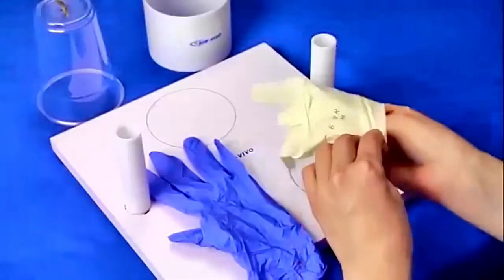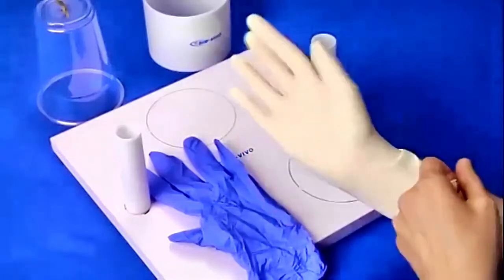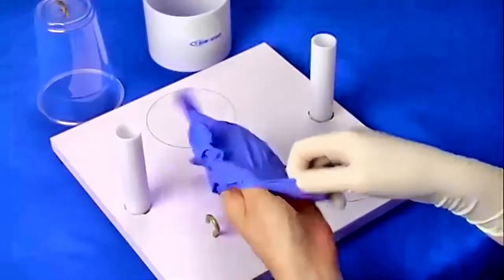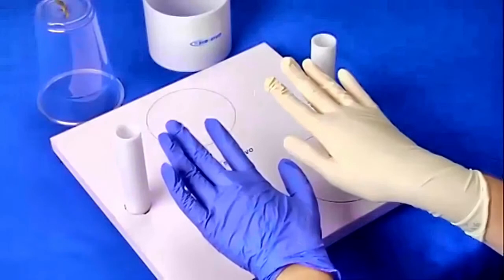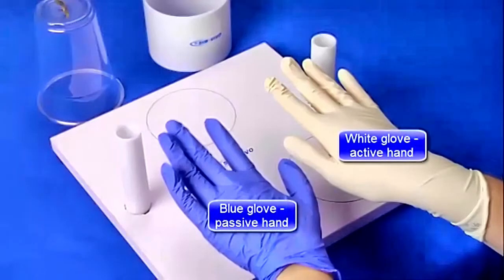Now, which of your hands will do what? There's no easy answer to this, but for most people learning this task, the active hand will be the dominant hand, although some learners prefer the opposite. We suggest that you watch the training videos and decide which hand you're most comfortable with doing the active tying. To help make things clear, we're going to put a white glove on the active hand and a blue glove on the passive hand.